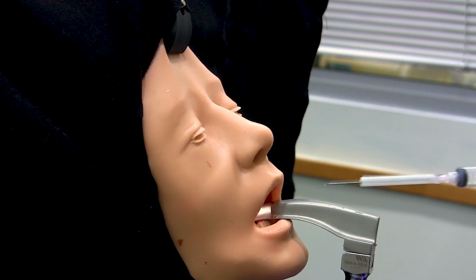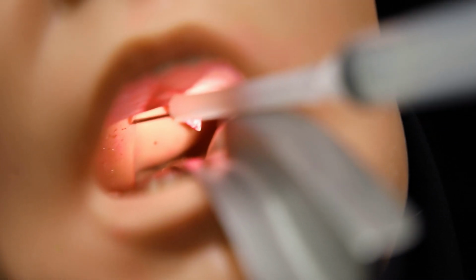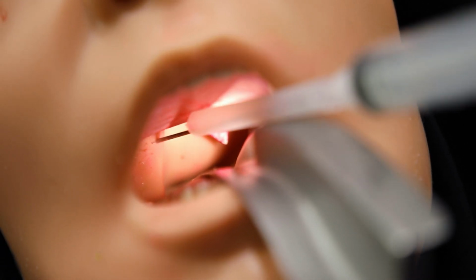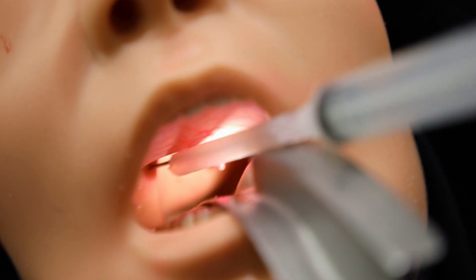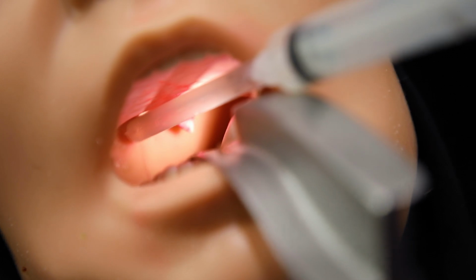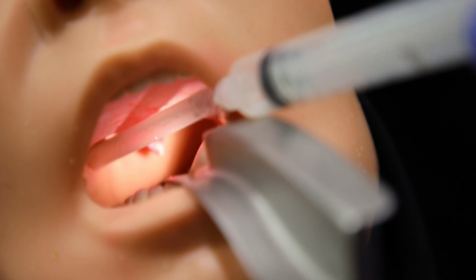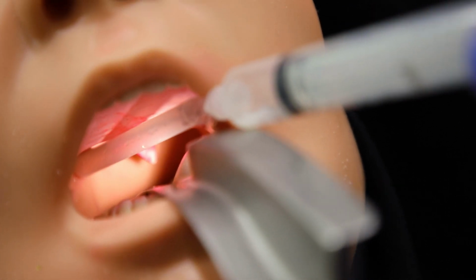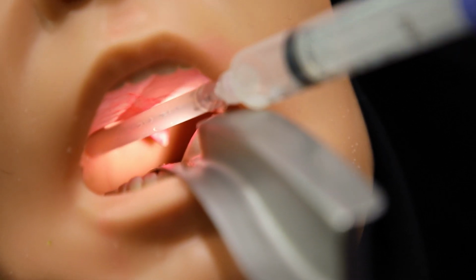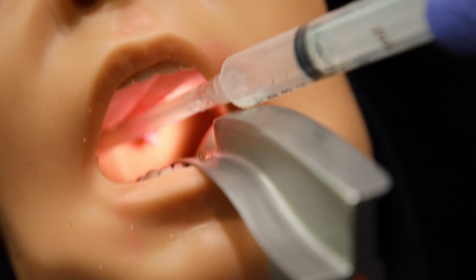So taking the needle, I'm going to go ahead and advance to that superior lateral position. I'm going to aspirate as I advance. And typically, you're looking to get out about 1 cc of pus. Sometimes really large ones will be several cc's, but it's not uncommon to not get out a whole lot.